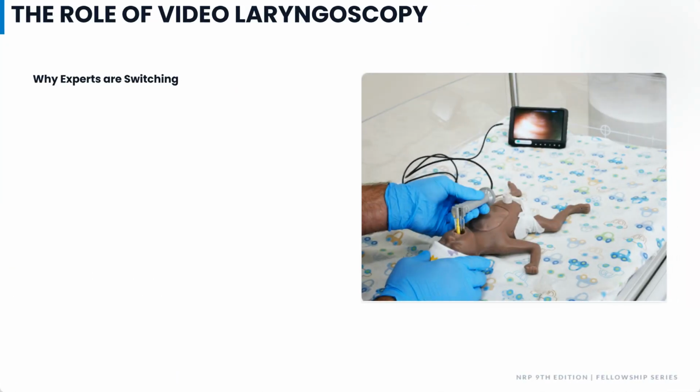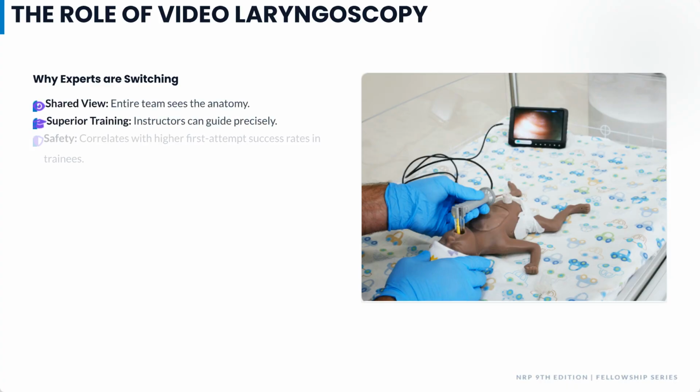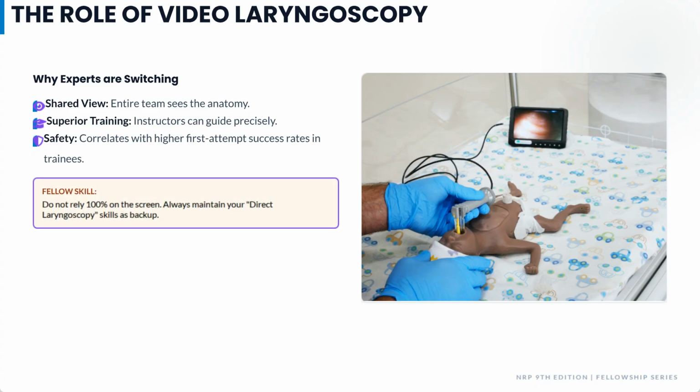Video laryngoscopy is increasingly used by experts for shared team view, superior training opportunities, and improved first attempt success rates. Remember, do not rely solely on the screen. Always maintain your direct laryngoscopy skills as a backup.